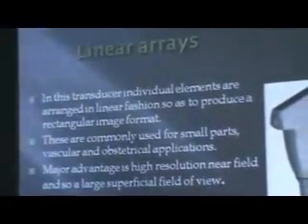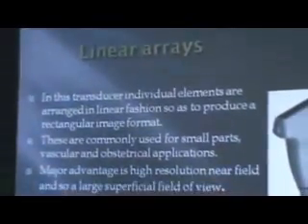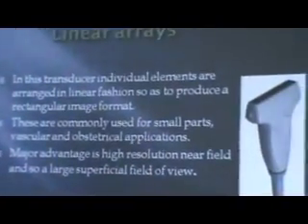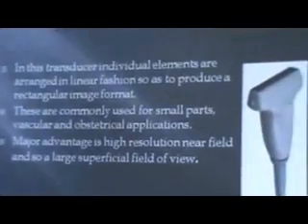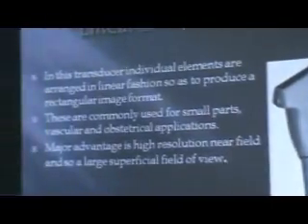In the linear array transducer, individual elements are arranged in a linear fashion so as to produce a rectangular image format, and these are commonly used for small parts, vascular, and obstetrical ultrasound examinations. The major advantage of linear array probes is high near-field resolution and a large superficial field of view.